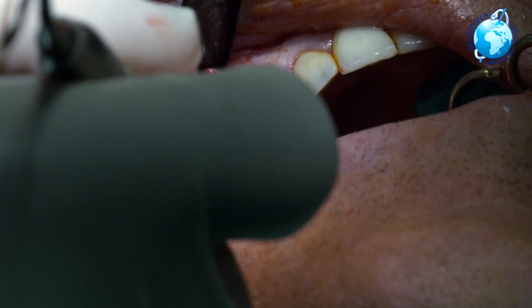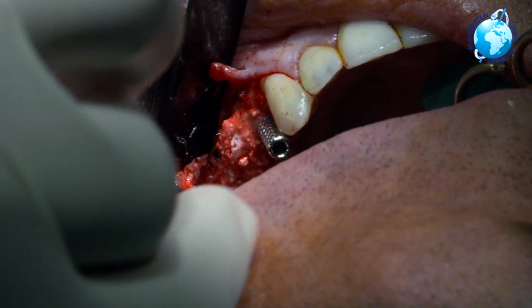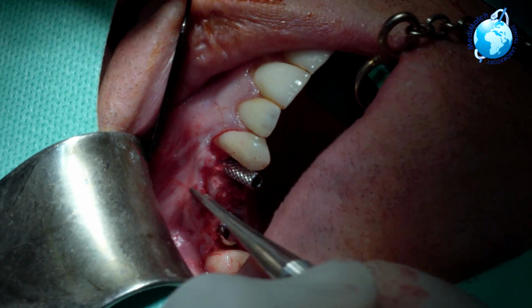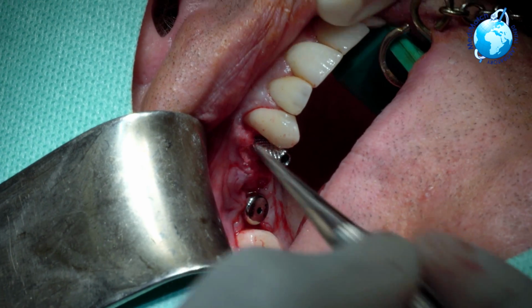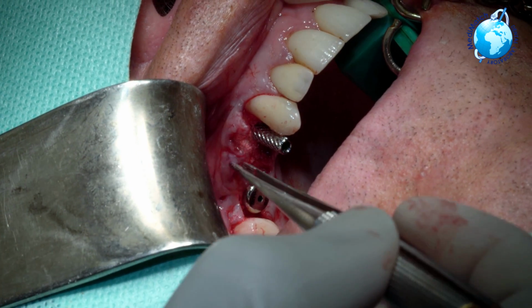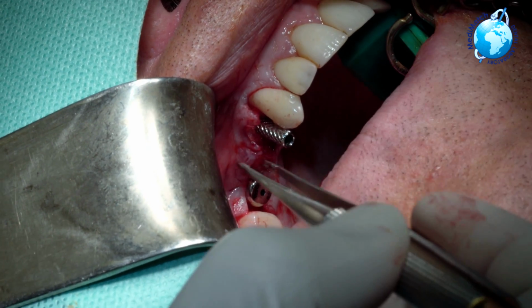Now with Ethos you can see it's a bit slumpy, so we're going to just set it now. So obviously this is going to dry that up. It's really good. It's your 5.0 Perma-sharp, or 5.0 Vicryl. Okay, so now we're just going to gently put the tissues back. You can see no relieving incisions were made, and just close things nicely here.